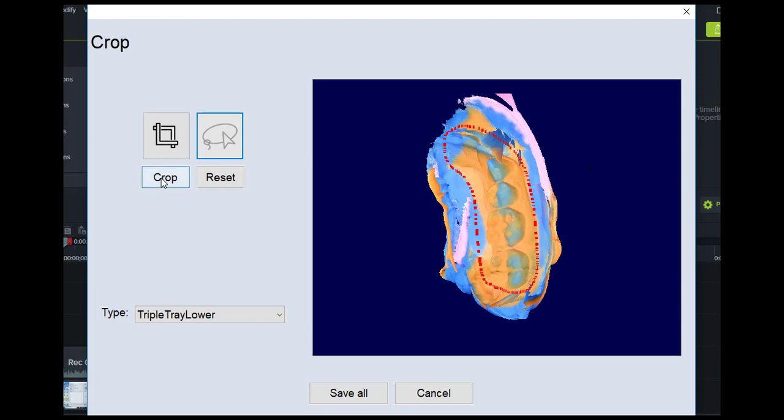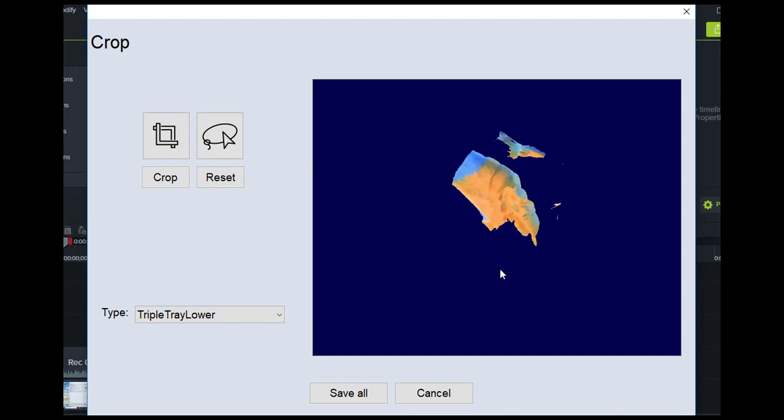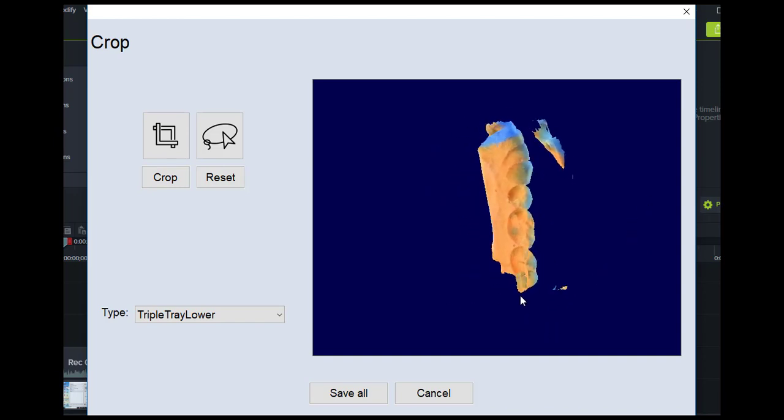With that done, hit crop, and you'll see that this is going to crop that model down, gets rid of all the excess data. We could also come back and do that one more time. Let's encircle the part that we want to keep and get rid of any of those little floating bits of noise. And with that done, we can go to the upper impression.